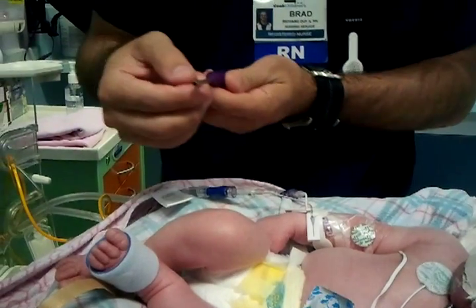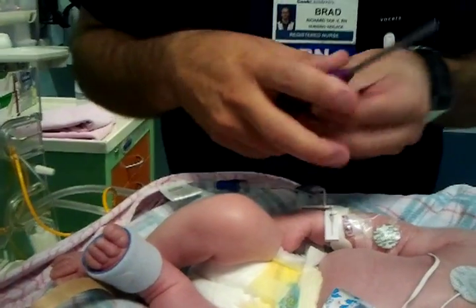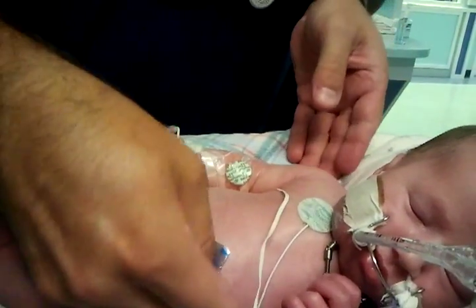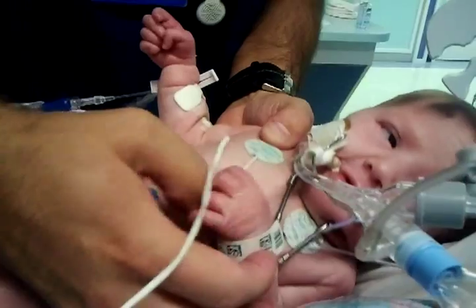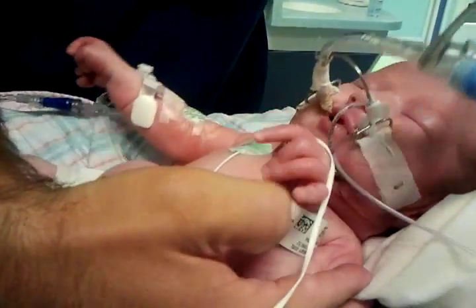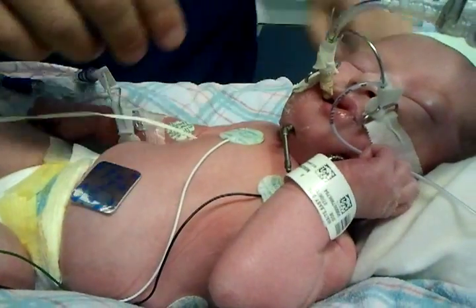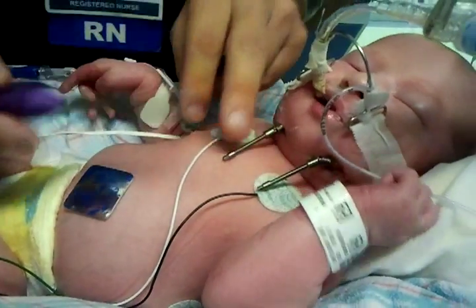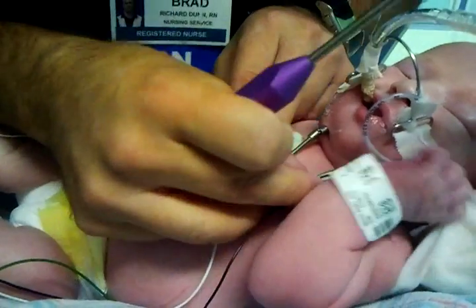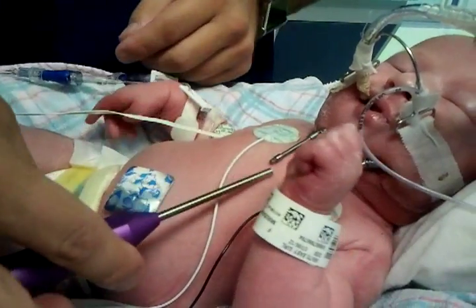You see that the numbers are up here, the lettering is up here. Let's put her in a better position — I'll just kind of put her back in. You can see here, the red is on the top. This one's a little bit off, but generally speaking it's on the top.